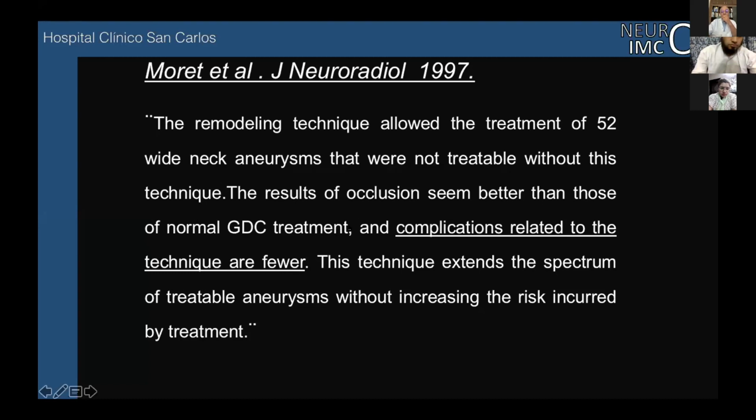And discuss at the beginning when I treated the aneurysm with the balloon in the sac, is the technique of Serbinenko and Moret with the HEMA. I have some cases where I have a rupture of the aneurysm, and some discussion is the radial force of the balloon at the neck.